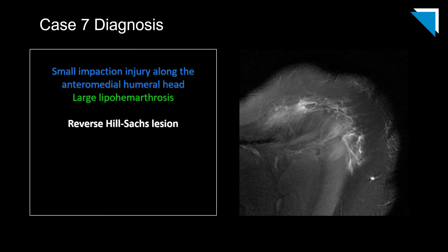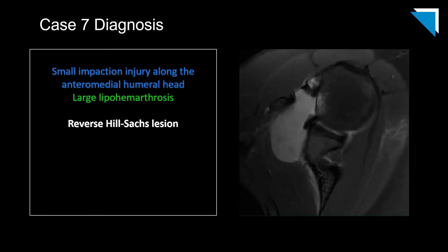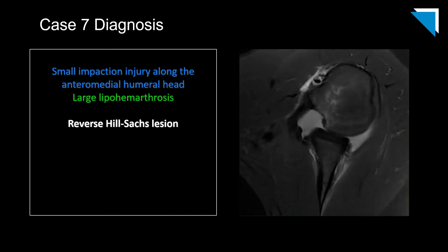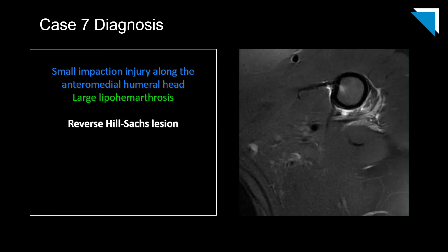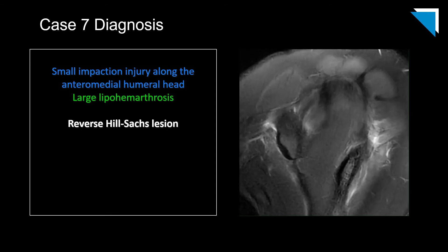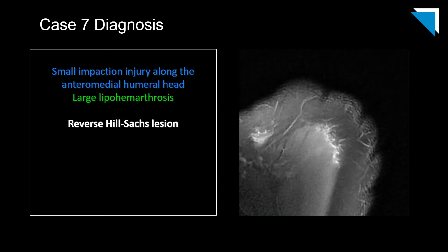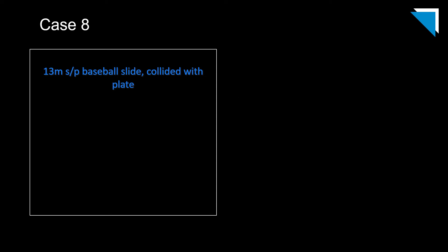I wanted to scroll through one sequence from the follow-up MRI to show how well fat-suppressed fluid-sensitive sequences bring osseous injuries like this into sharp focus — the bone marrow edema really stands out and draws attention to the impaction injury. MRI is much more sensitive for evaluating the labrum, and we see lots of labral injuries with both anterior and posterior dislocations.